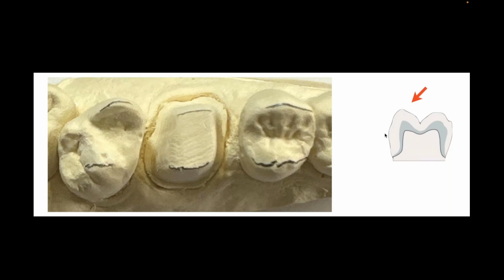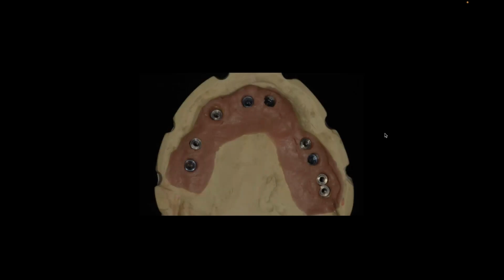I could show you so many of them in my text because when they go to posterior teeth, they tend to think about making nice walls and having a retentive form. They're not thinking of the aesthetics or the functionality like they are when they're prepping an anterior tooth. And they're thinking, oh, I got to roll that incisal edge, otherwise my tooth is going to be out too far in the arch. Well, this is worse because without rolling that third plane on the tip of your molar, functionally, now I need a stronger material, otherwise the material is going to break. So that's where I kind of get a little antsy with how we're teaching this today without really teaching the core. And I can tell you I've been doing this kind of the same way for a lot of years, right?